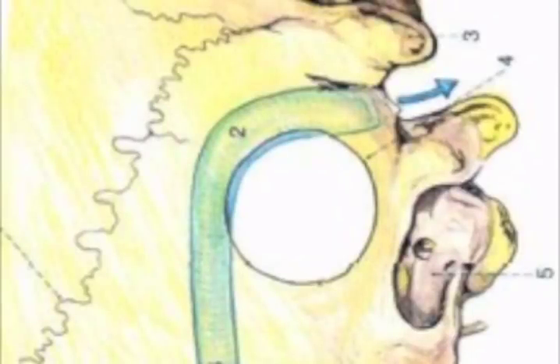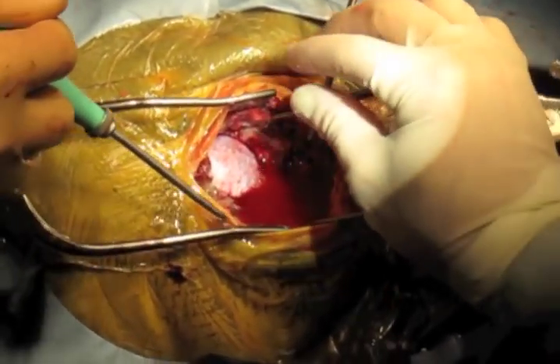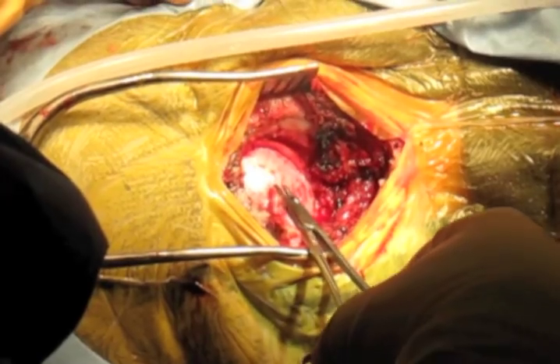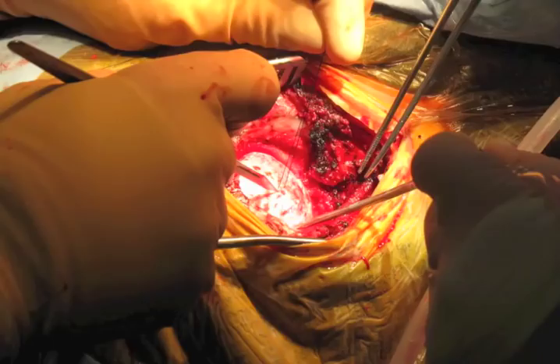Once an appropriately sized craniectomy has been achieved, meticulous hemostasis is obtained and the wound is copiously irrigated to remove bone dust and debris. The dura is opened in a linear fashion down towards the foramen magnum with a 4-0 silk suture, 11 blade, and either long straight scissors or dental tool.